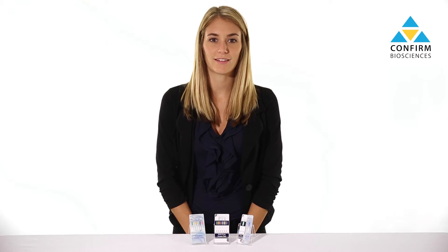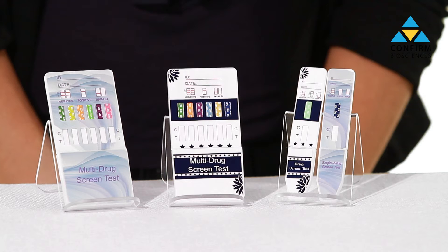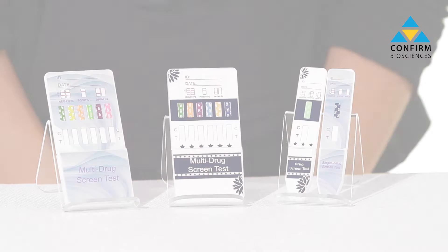Hi, my name is Sophia, and in this video I'm going to show you how to use drug testing dip cards. Our dip cards are available in a variety of different configurations, from single panel tests to 12 panel tests.